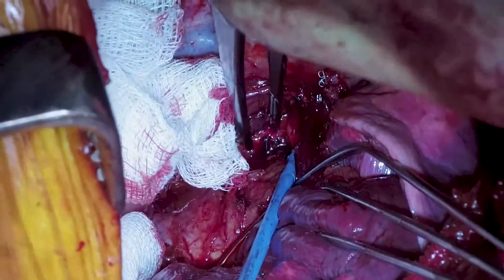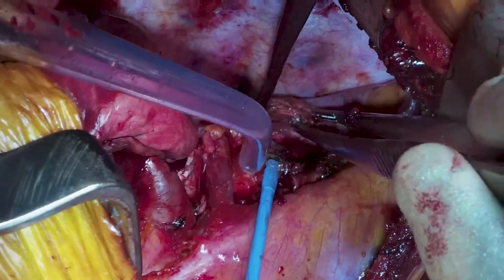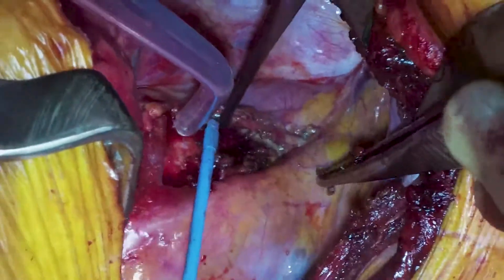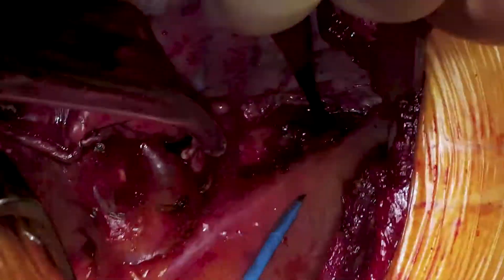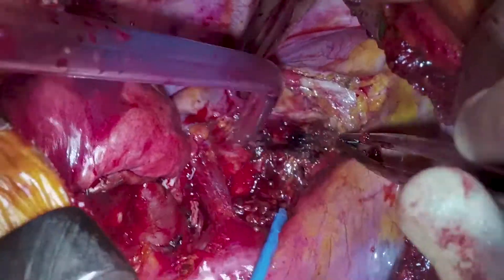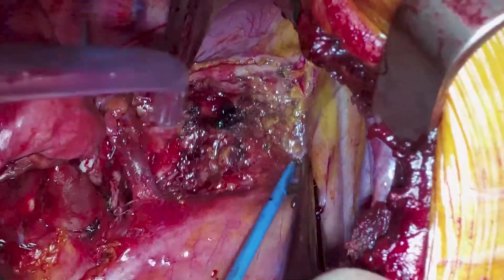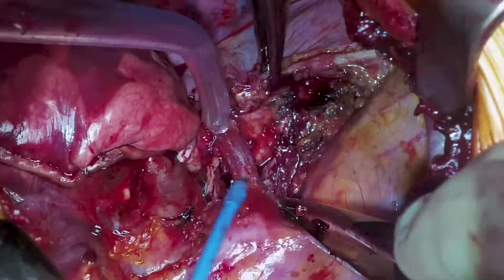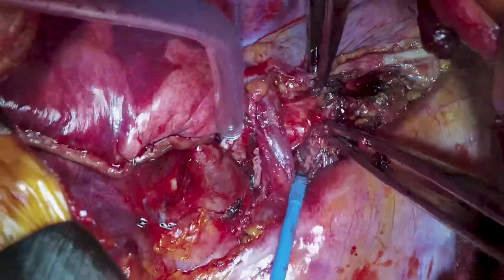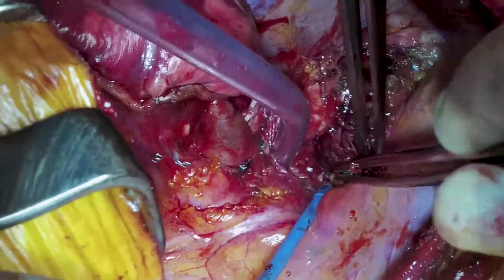This is actually the most important point of the whole video. This is station R2-R4 — you can see the trachea and the superior vena cava. This packet of lymph nodes was really adherent because she'd had previous mediastinoscopy and neoadjuvant chemotherapy. Pre-operatively, this was the packet of lymph nodes that she tested positive on. Post-op on histology, all of these lymph nodes were negative because of the neoadjuvant chemotherapy — all of the tissue was dead inside, meaning the cancer was completely removed.